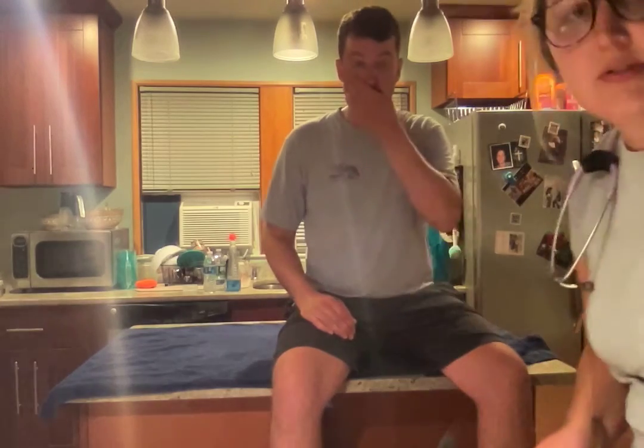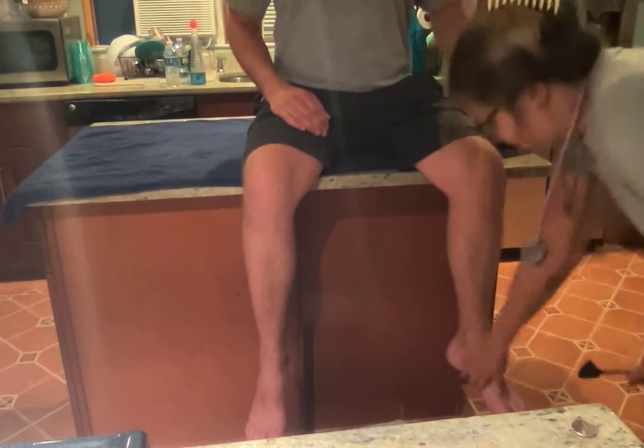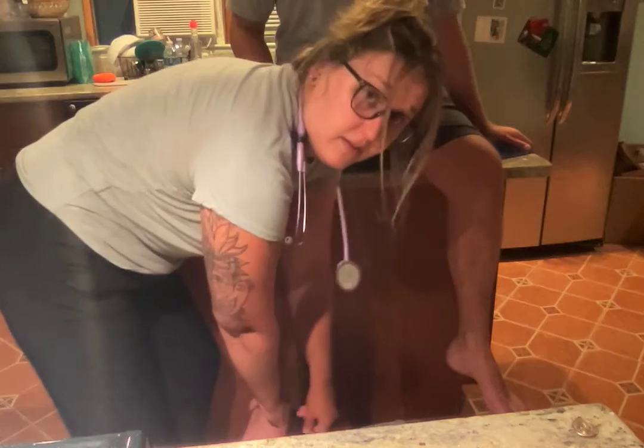Good. And then I'm going to just adjust my camera to make sure I can get your feet. I'm going to hold the inside, and I'm going to brush with my reflex hammer. And he does not have a Babinski, which is good. It's a positive thing. So inside of the foot, I'm going to brush up. No Babinski, which is good.